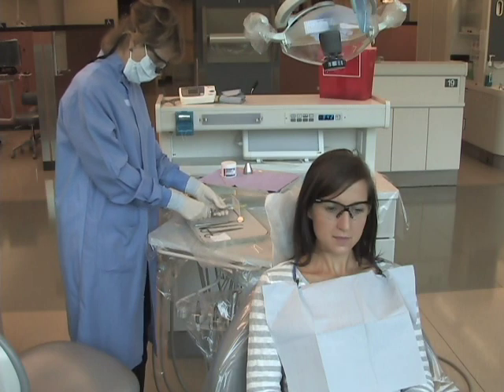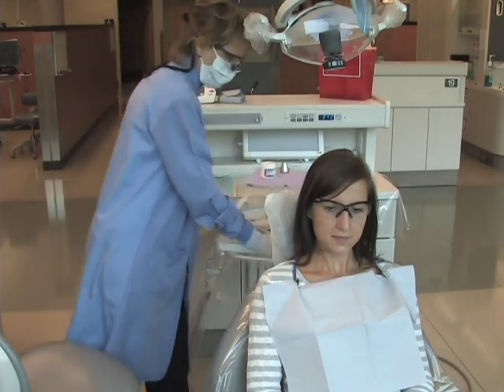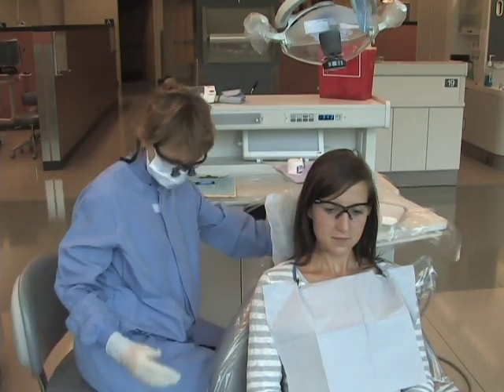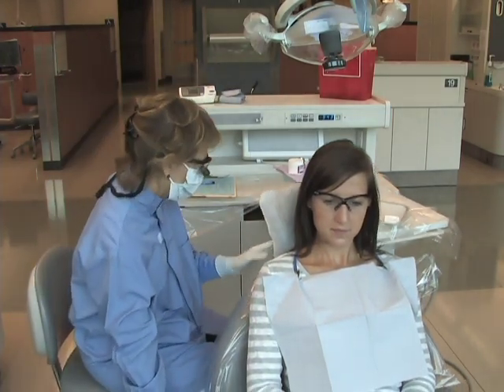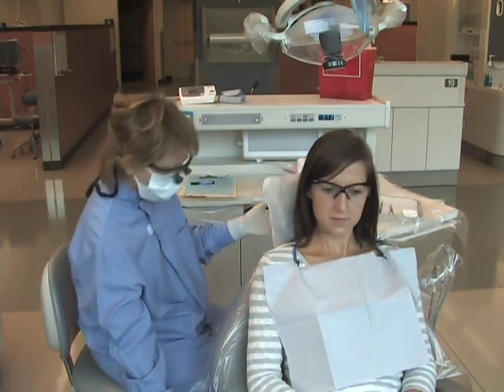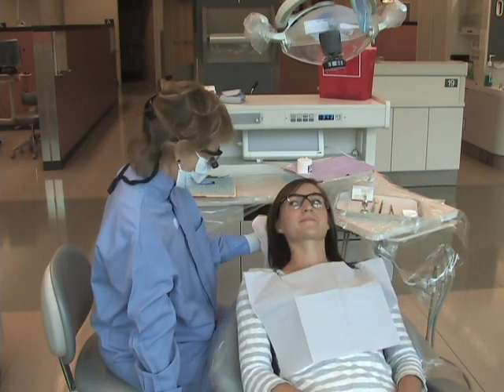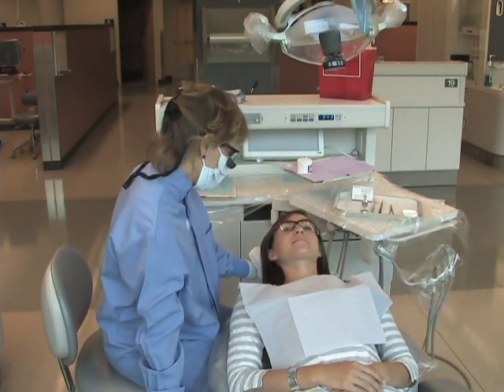Next, position the patient and yourself. With the patient in the supine position and mouth wide open, the operator should have adequate access and visibility. The patient's head should be adjusted so that it is comfortable for the operator during this procedure.